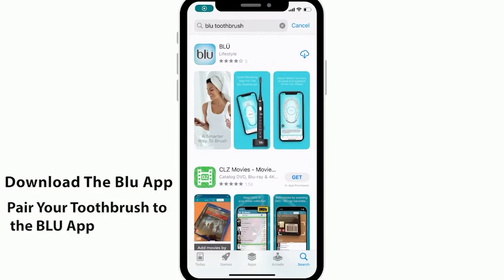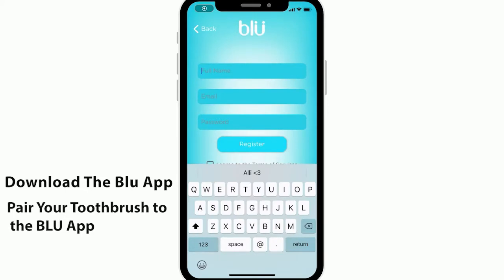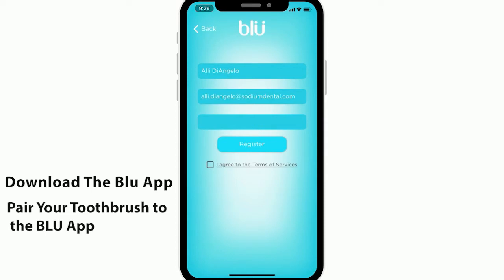While our BLU toothbrush charges, we're going to want to download the BLU app to get prepared to use your toothbrush for brushing. So you're going to want to open the App Store and download that, and let your settings have the Bluetooth setting available for your toothbrush. I'm now registering for my account. I'm putting in my information to sign up with my email. You can use Facebook or your Apple Store for this as well.